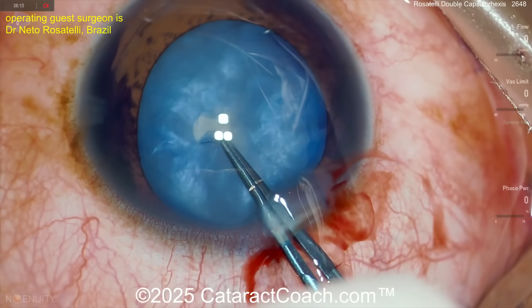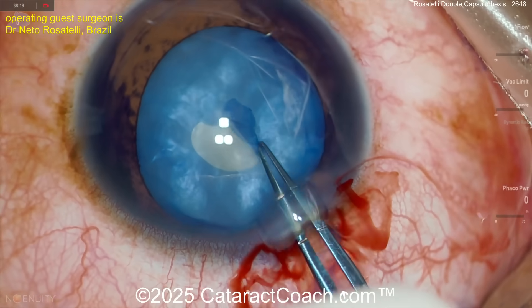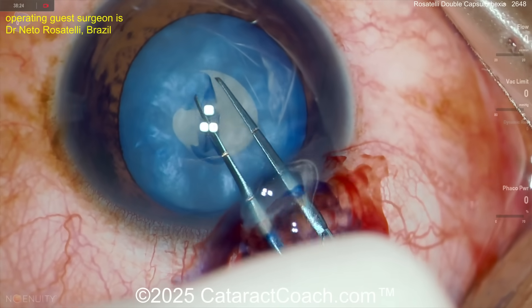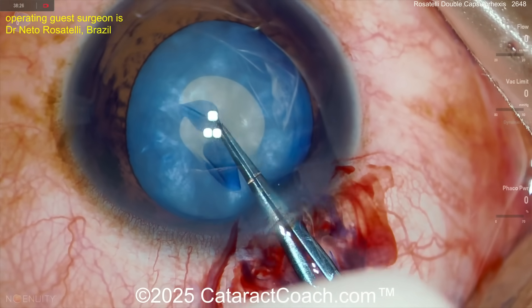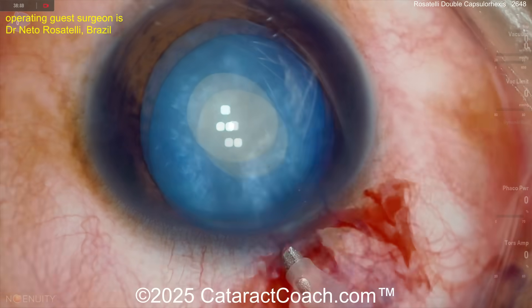Maybe a little bit of milk, but starting off with just a first small baby rhexis. Why? Because the rhexis has no edges that are going to run out, and from this we can decompress the bag. Completing that baby rhexis — there's the first rhexis.